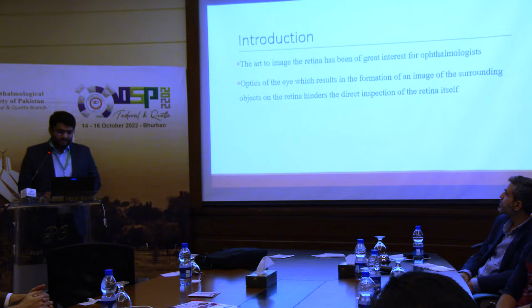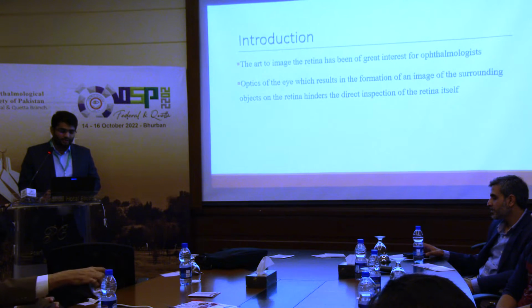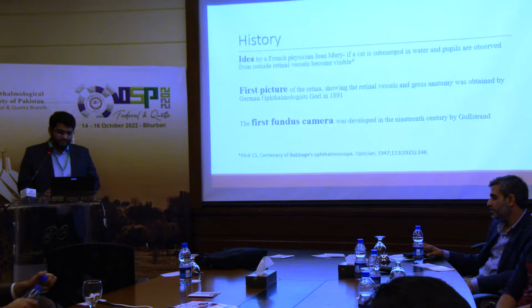The art of imaging the retina has been of great interest to ophthalmologists, and the optics of the eye, which in fact form the image on the retina, basically hinder the direct photography of the retina itself.